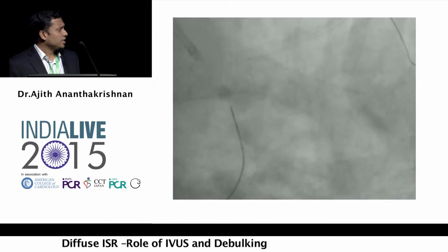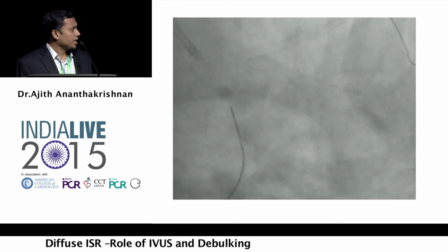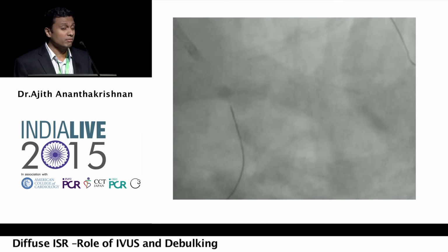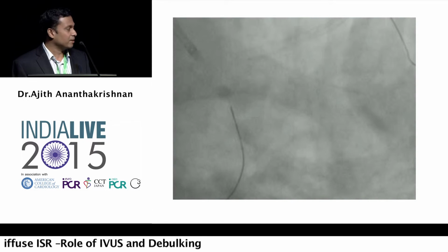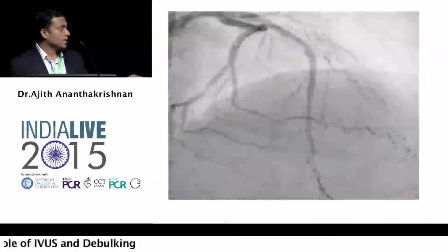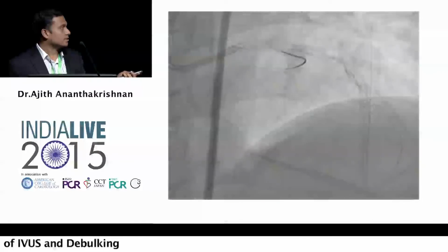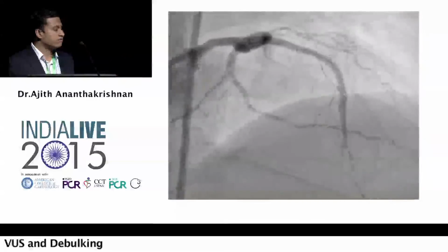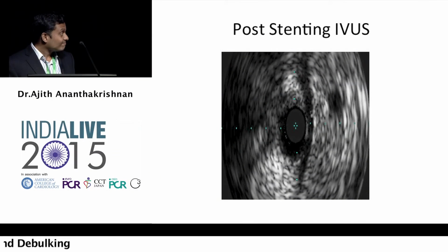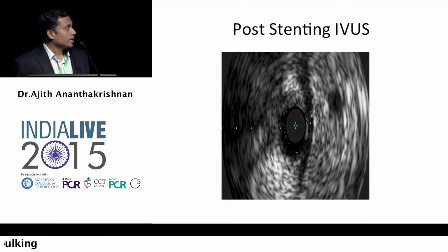Now, this was the angiography after the stenting. More importantly, we deliberately avoided balloon dilatation of the distal bed, because we'd end up in messy dissections and then outflow occlusions, which would eventually damage all the good work we have done proximally. So the idea was to do a standalone rotablation of the distal bed and then optimize the stenting of the proximal and mid LAD coming back to the left main. Sorry, back. Can you play this movie?